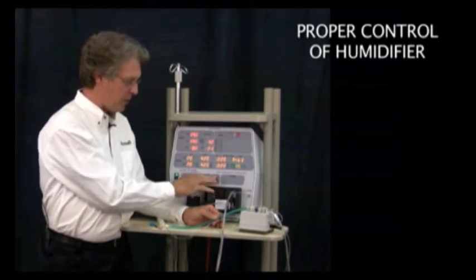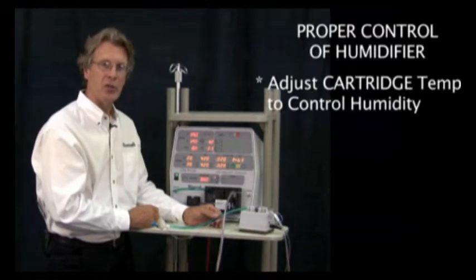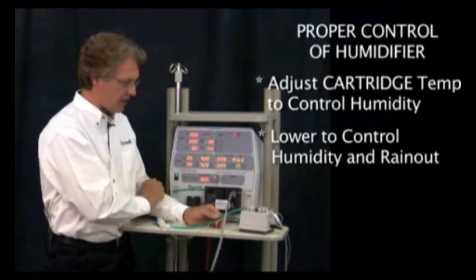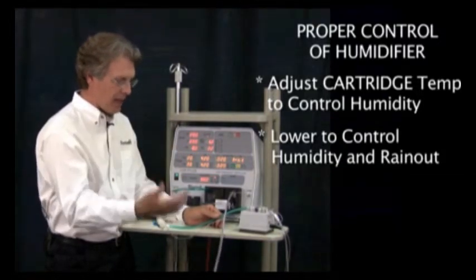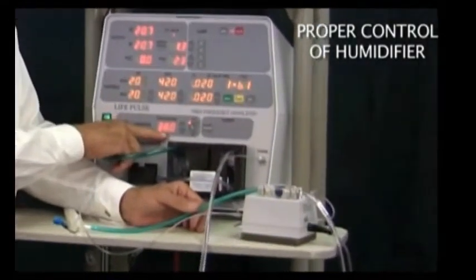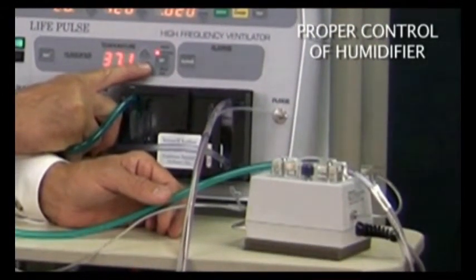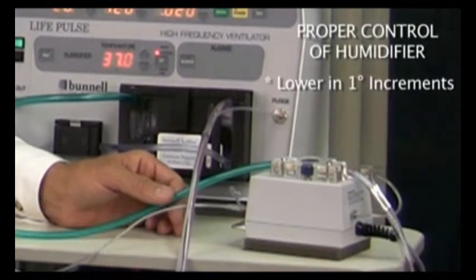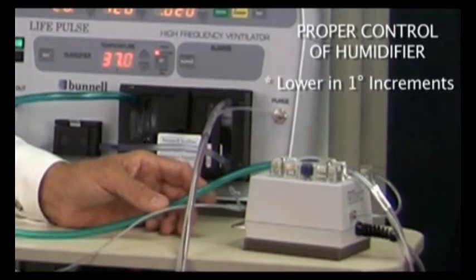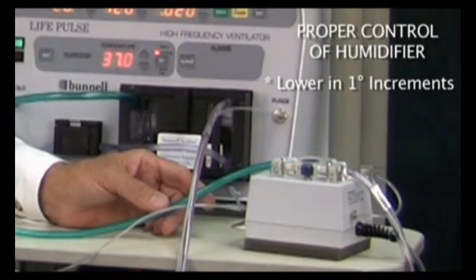What we do manipulate is the cartridge temperature. If the default value of 38 degrees is too high, then we want to lower that so that we're not putting quite as much water into the gas, and therefore minimizing the amount of rain out. So while the set point for cartridge is displayed, you want to lower the cartridge temperature, and the first time you want to lower it by 1 degree to 37 degrees centigrade. It will take approximately 20 to 30 minutes for the humidifier to readjust itself and to control that water bath so that it's actually at 37 degrees.